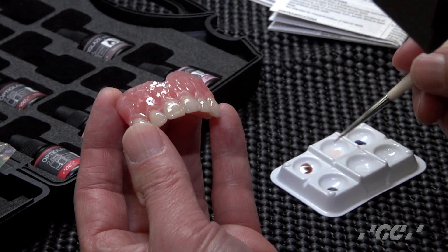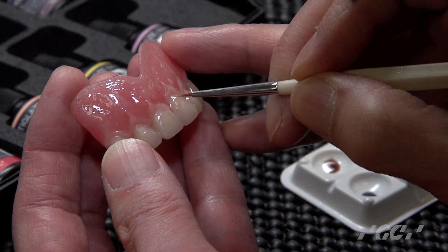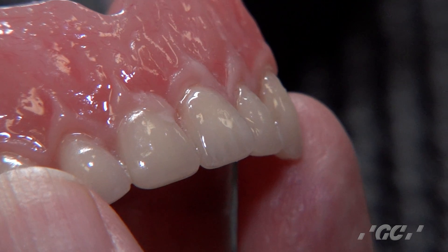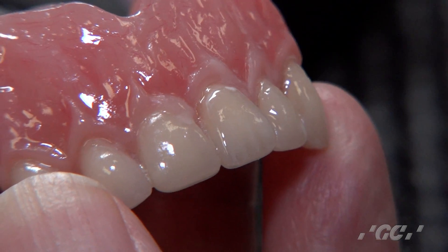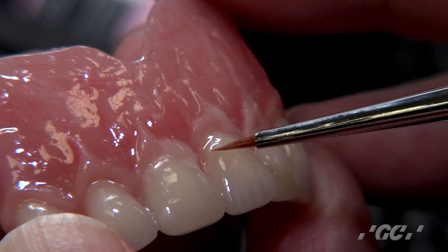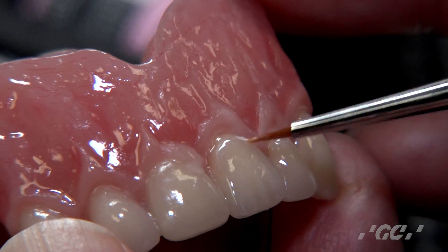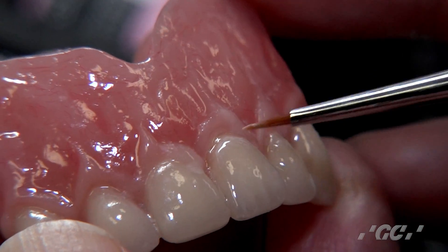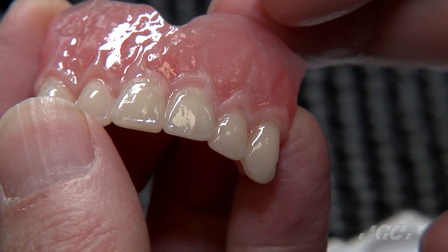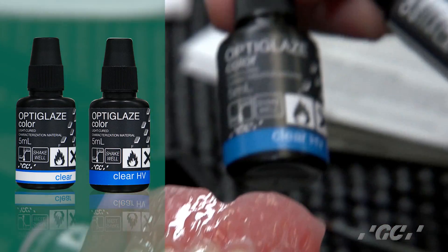If you want to add a little more color, continue with whichever color you want. Dilute the liquid with clear as needed. When you are satisfied with the colors, decide on your final coat before the final cure.